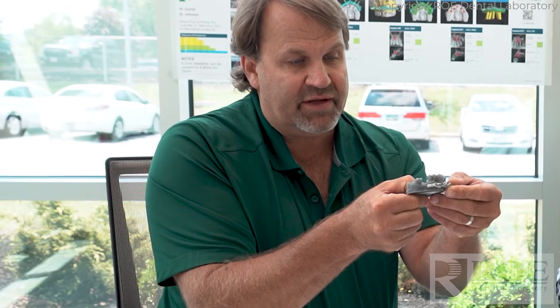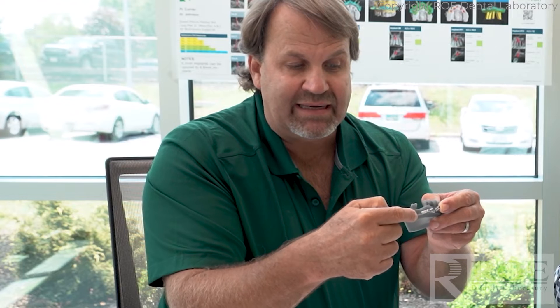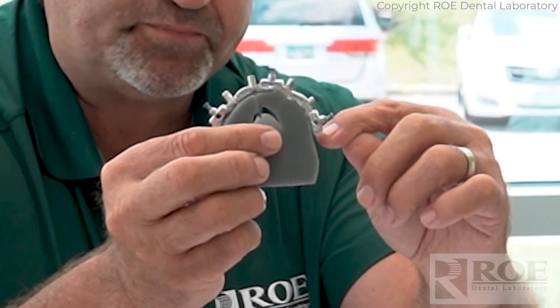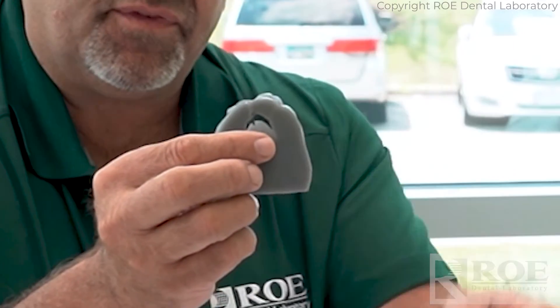One of the great things about Chrome is that we use the prosthesis as a guide. In the side view, this shows us where the distal-most posterior osteotomy is going to be. You can reflect or release distal off that last box or bar — just do a facial release there on both sides — then reflect the facial flap down. The metal is designed to fit on the outside of the tissue because it doesn't touch bone, so you're floating it in. You seat it with the patient lying down and use a 15 blade or a perio probe to make an index mark on the tissue.